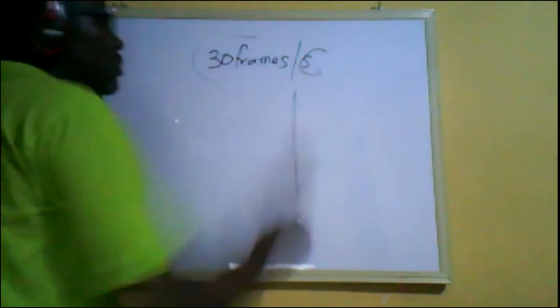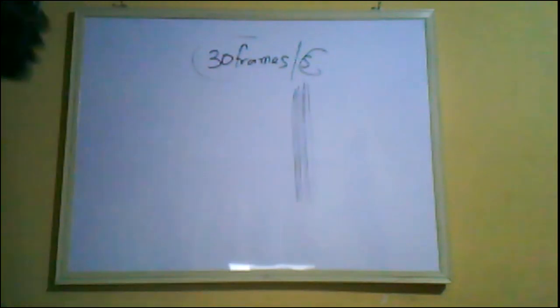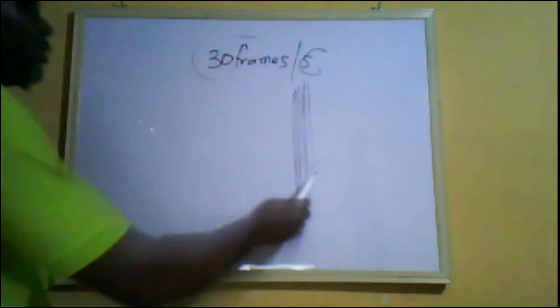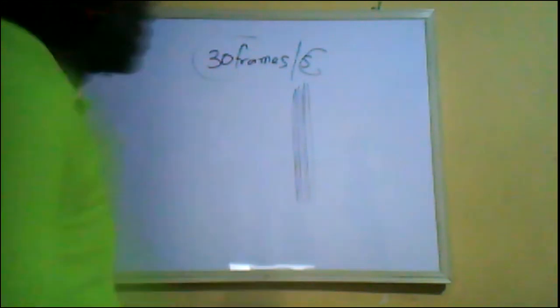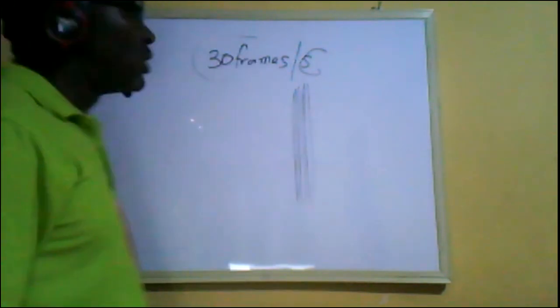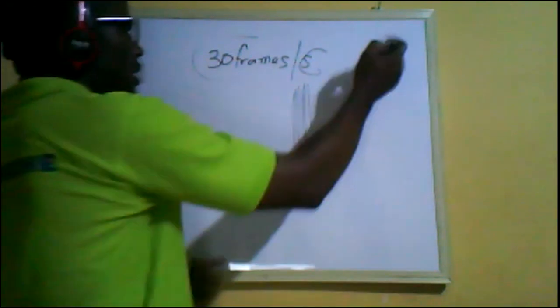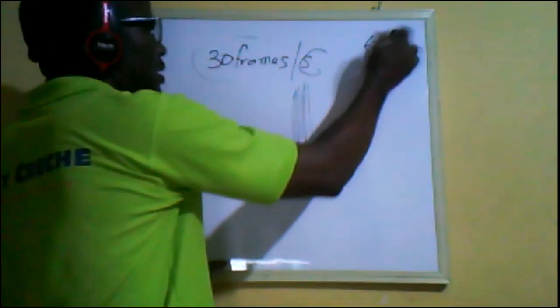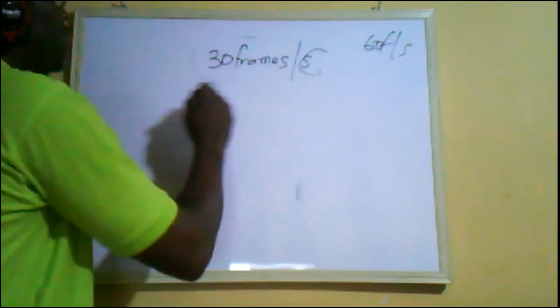In 1 second, the images coming from a position will come at the rate of 30 times, to be exposed 30 times every second. But remember what we said about flicker: this has to be done in an interlaced fashion so that it will appear that we are firing at 60 frames per second.